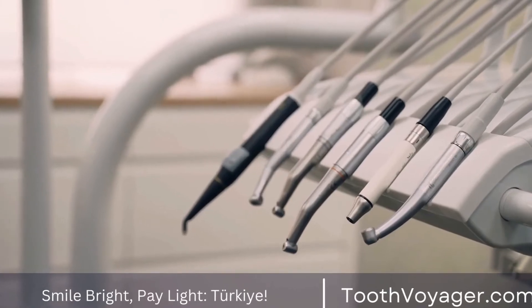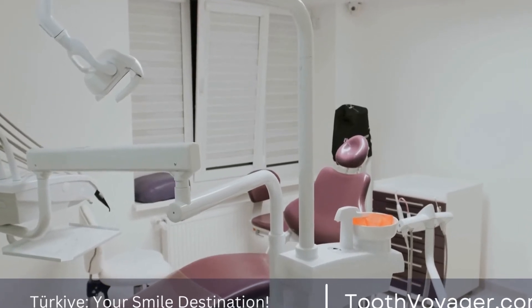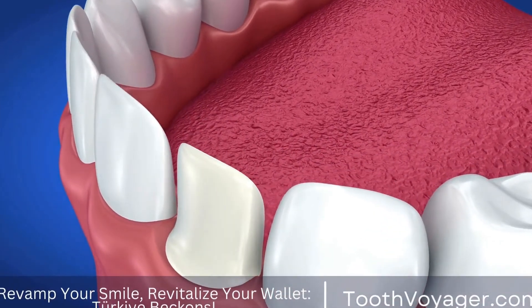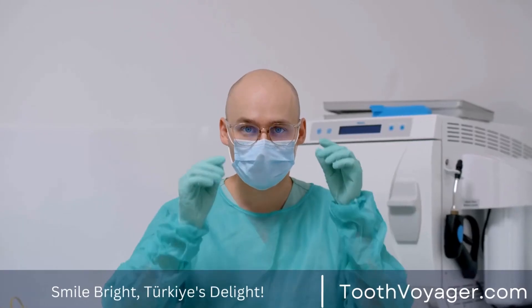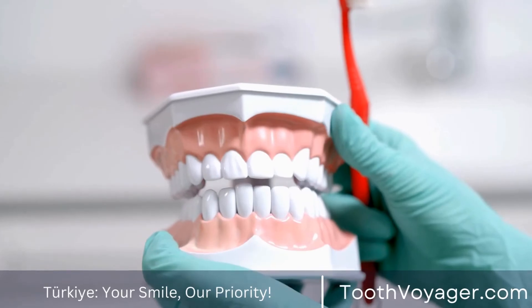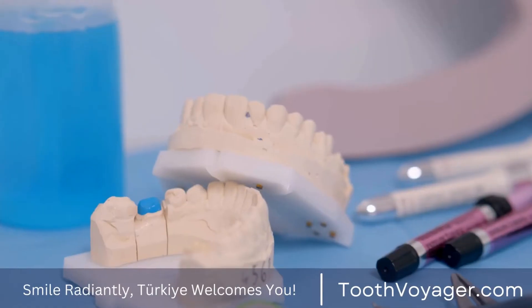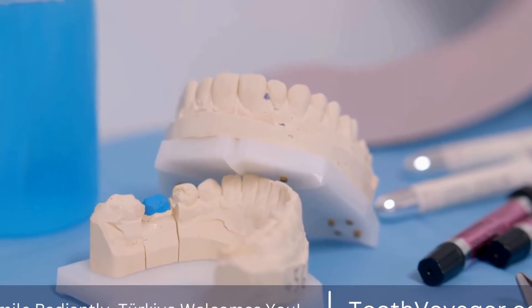Preparation and Placement. Before the veneers can be placed, the dentist will need to prepare your teeth by removing a thin layer of enamel. This is necessary to ensure a proper fit and to create a bonding surface for the veneers. Once the teeth are prepared, the veneers can be placed. The dentist will apply a special adhesive to the back of the veneers and then carefully place them over your teeth, making any necessary adjustments to ensure a comfortable fit before securing the veneers in place.